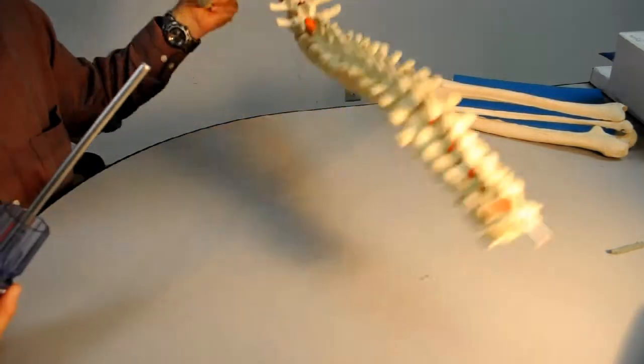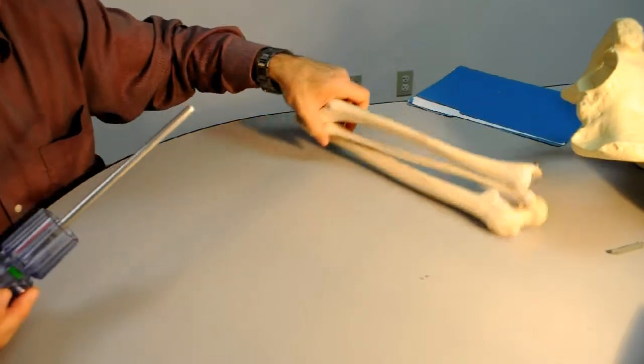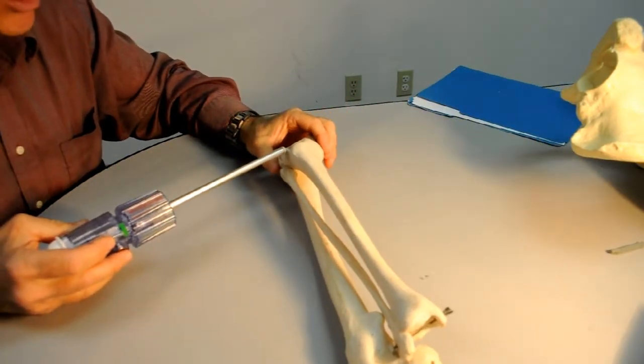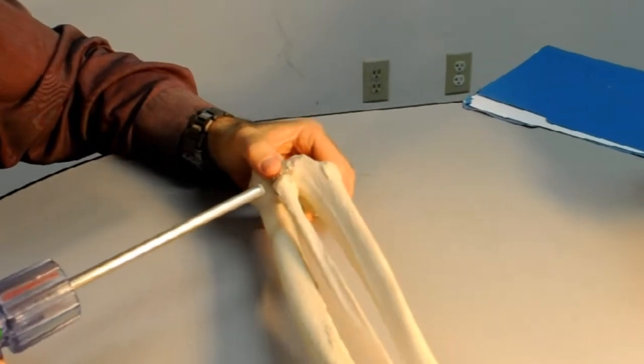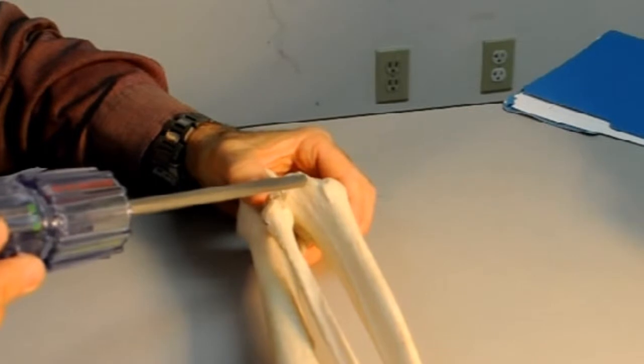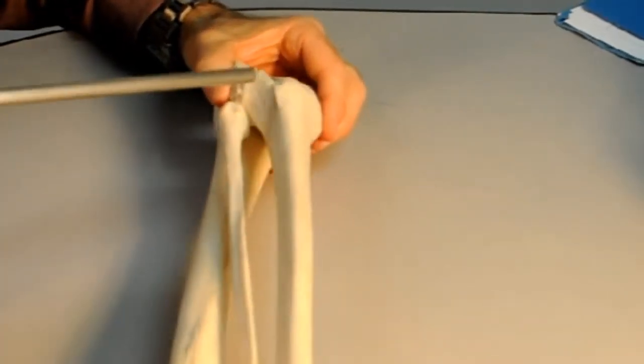For lateral decubitus and supine position patients, I would highly recommend one consider the proximal tibia. For the lateral decubitus patient, one would harvest bone from the proximal tibia in the lateral area, just lateral to the tibial tubercle.